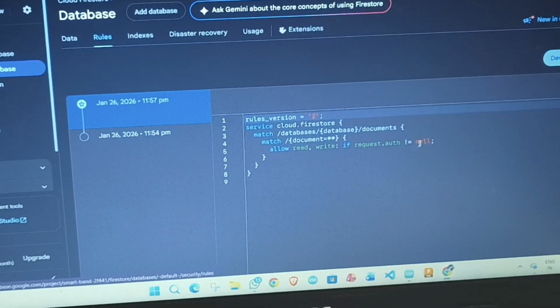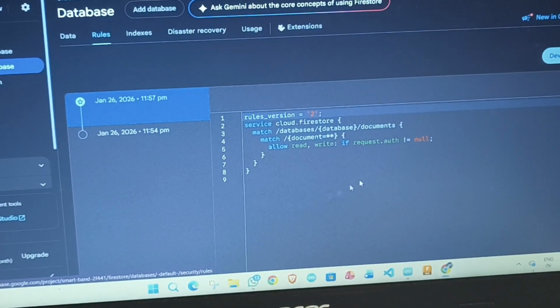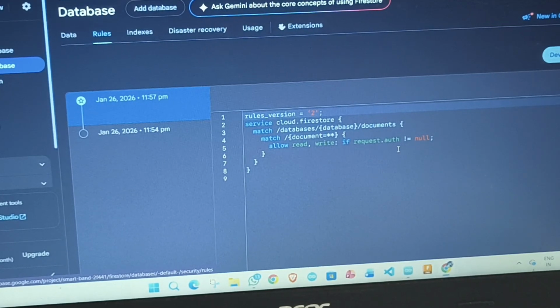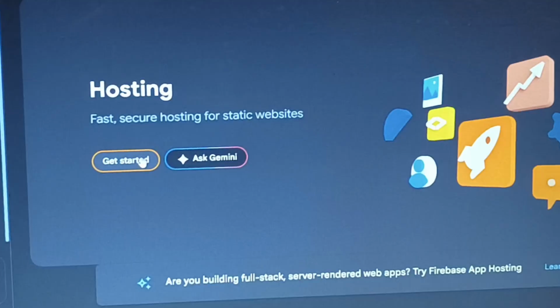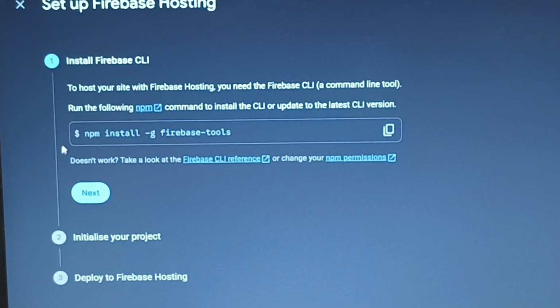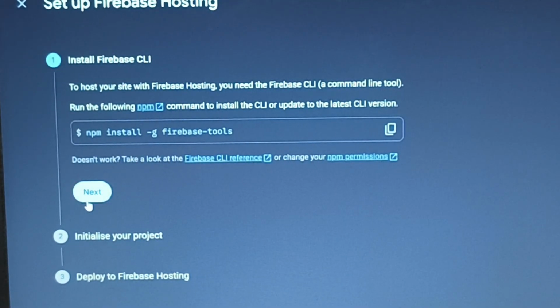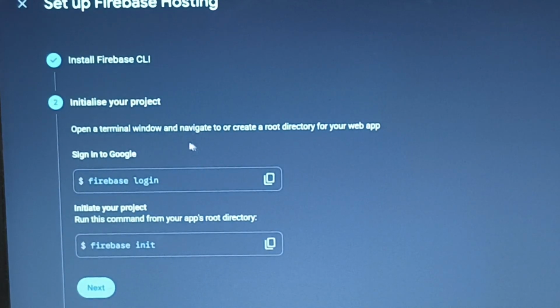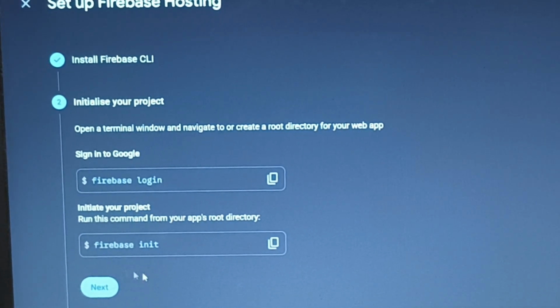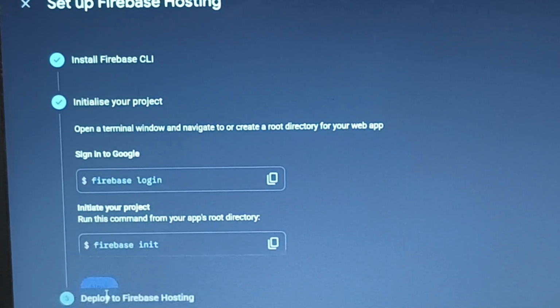To update this rule part, when you create your project, to read and write the data the request must be authenticated. This is how you can host. First, you need to install this. Then you need to log in to your ID in Firebase, and then go to your app root and run the init function.